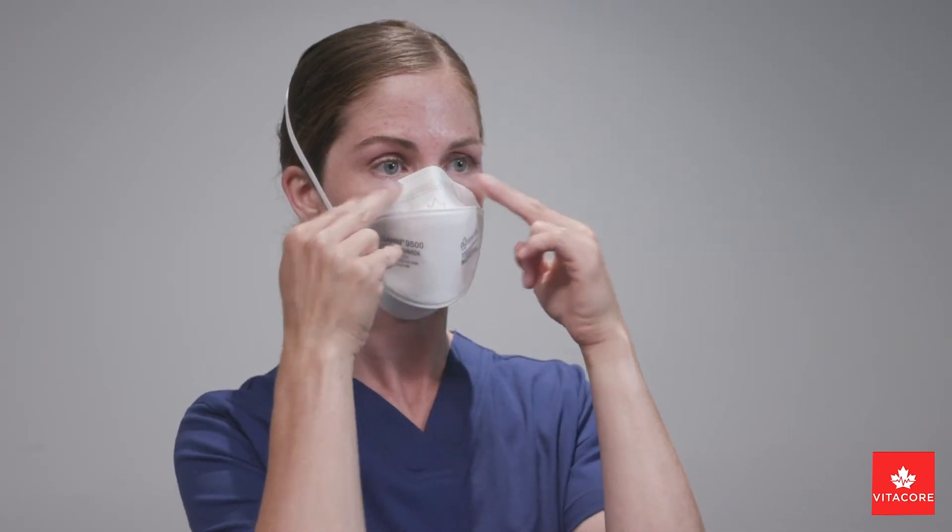Place two fingers from each hand on the top of the nose bridge and press down along the nose wire, molding it to the shape of your nose. Always use two hands.